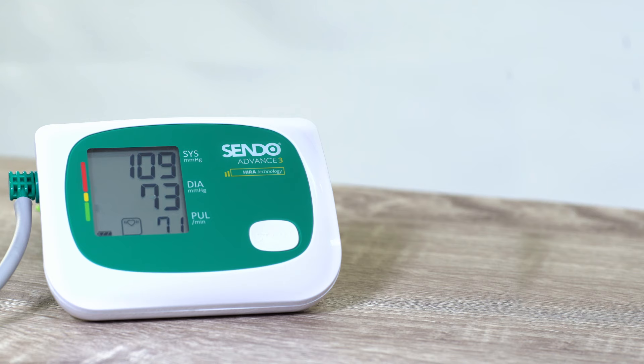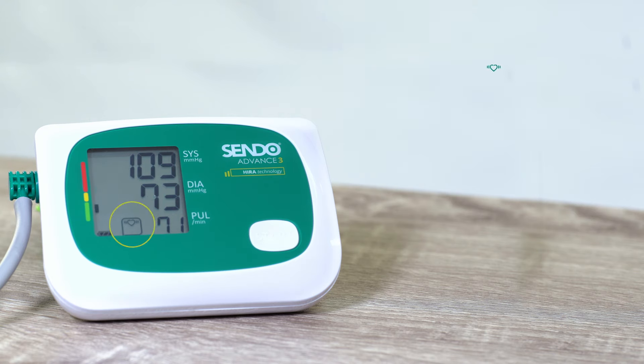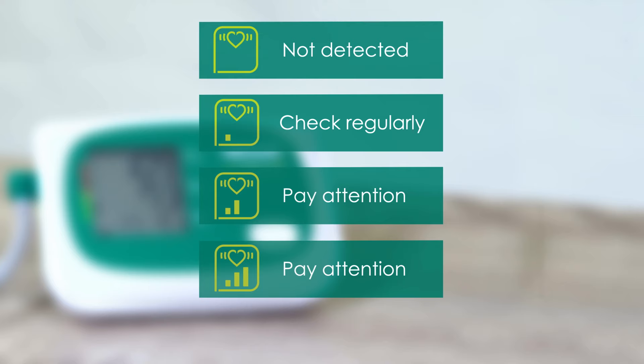Special HERA technology detects any irregular heartbeat during measurements. After the first 7 measurements, the HERA technology will analyse your irregular heartbeat and classify it according to severity to show one of the four status icons.